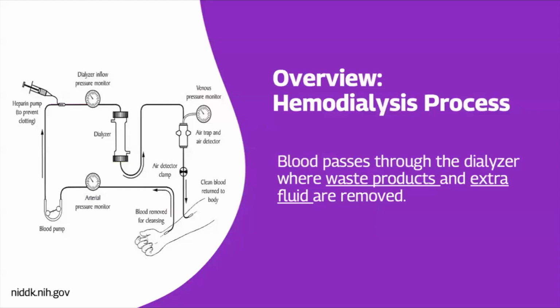The blood is accessed and circulates through the dialyzer on one side of the semi-permeable membrane. The ultra-pure dialysate bath circulates on the outside of the semi-permeable membrane of the dialyzer. About 250 cc's of blood is the average amount outside the body at any one time.